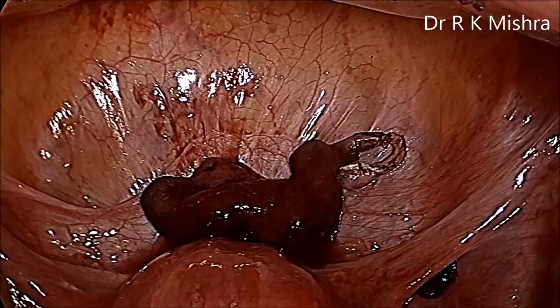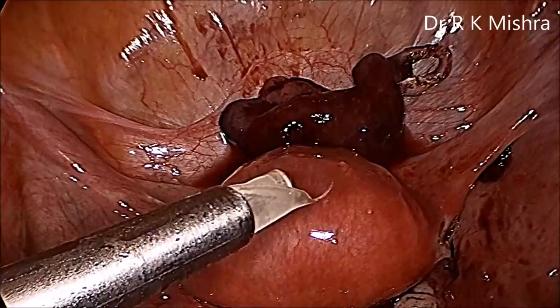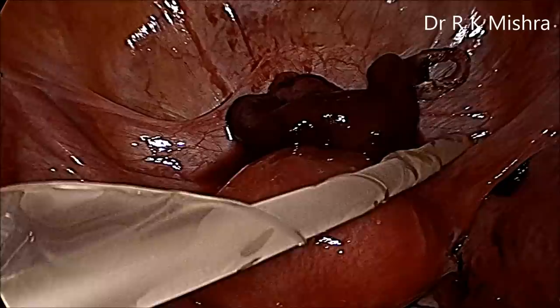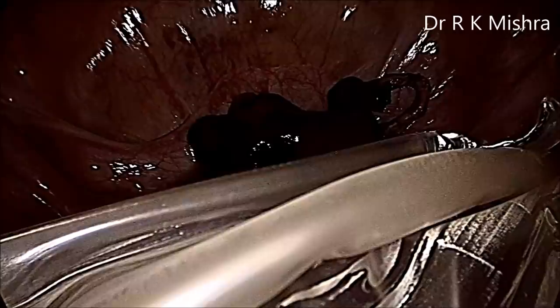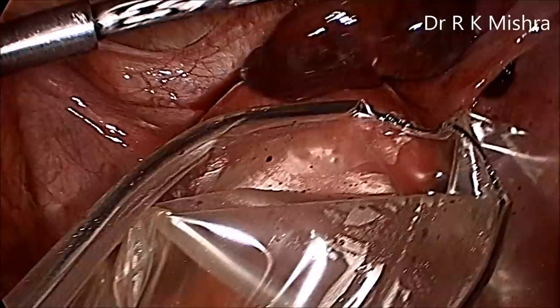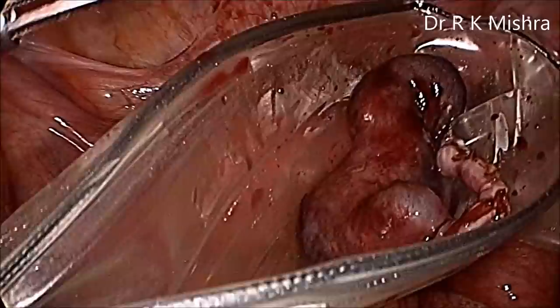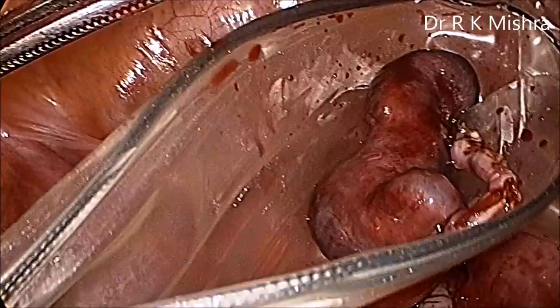Now we will use an endo bag. This is the EndoCatch — a commercially available endo bag with a metal ring. This is a very good self-retaining endo bag. The endo bag is opened and then the trophoblast with the ectopic is placed inside. It already has a purse-string suture which you can pull outside, and the endo bag will be automatically closed.